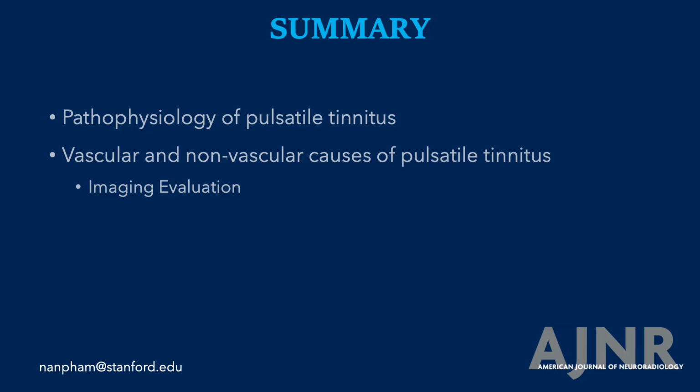In summary, we discussed the pathophysiology of pulsatile tinnitus, as well as both the vascular and non-vascular causes on imaging.